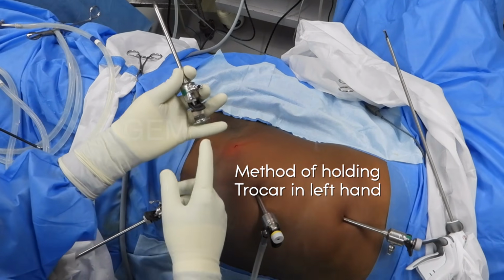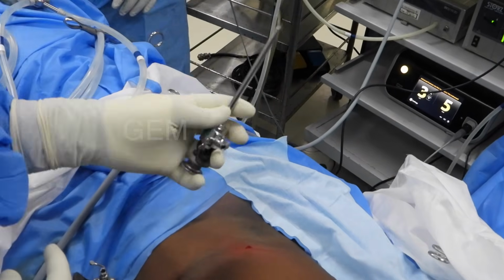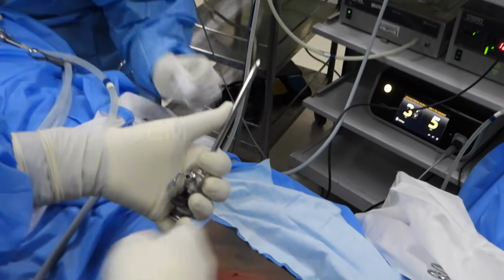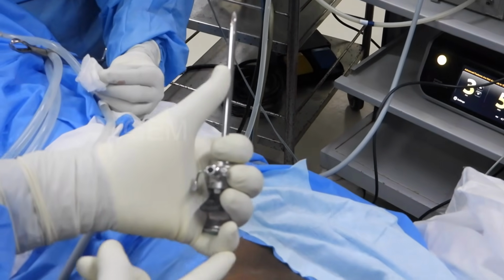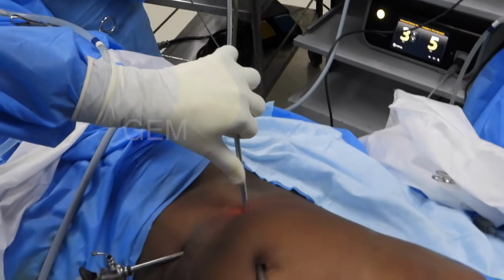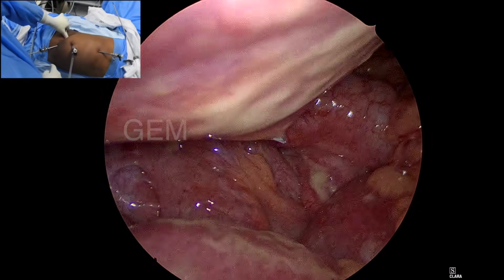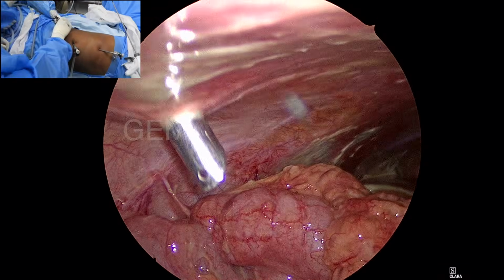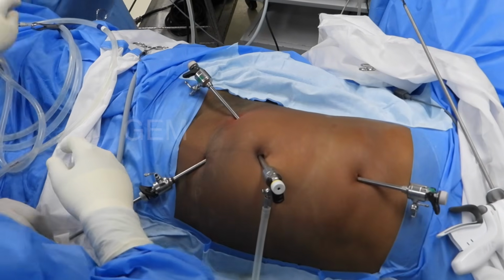So I am making the port in the right iliac fossa, on the opposite side, as I am standing on the left side. On the right side of the patient I want to make a trocar port. I hold the trocar like this in my left hand. This little finger will prevent the trocar from coming out when I introduce it, and this thumb will be the guidance, so only this much will enter inside. You can see the free movement of the instrument and wrist, and in a controlled way we can enter inside. This is the way I place a trocar on the side opposite to me, using my left hand.